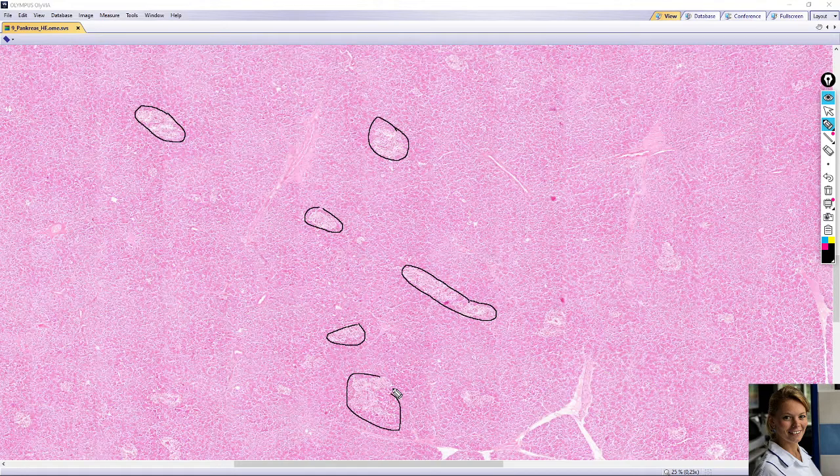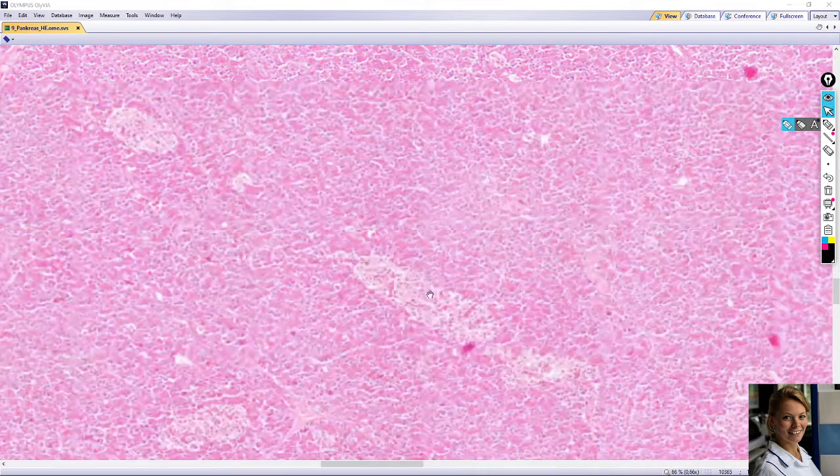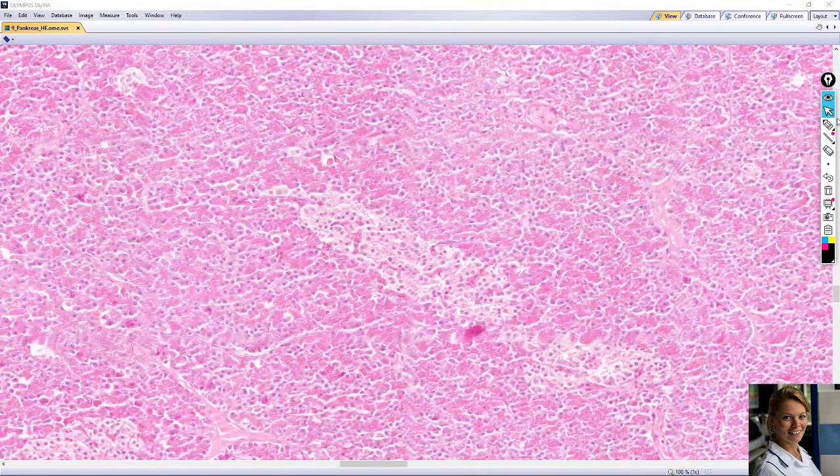The endocrine cells of the islets are arranged in cords and clumps, between which are found fine connective tissue and an extensive capillary network. For example, here very fine connective tissue is visible, and erythrocytes inside a capillary in the islets of Langerhans.